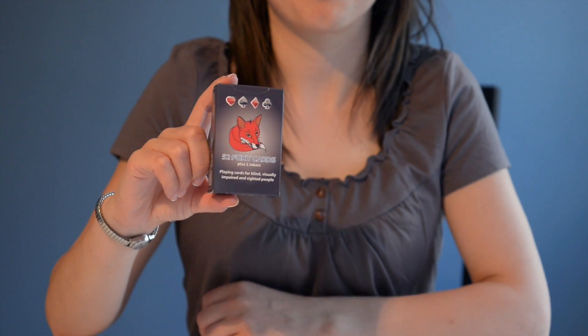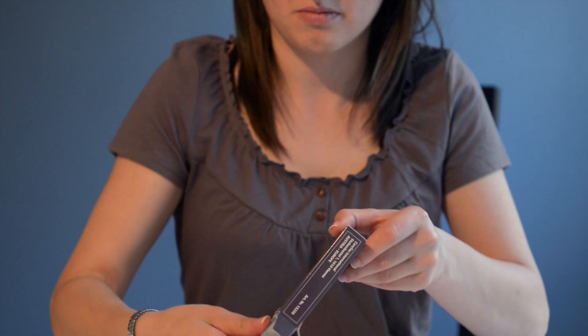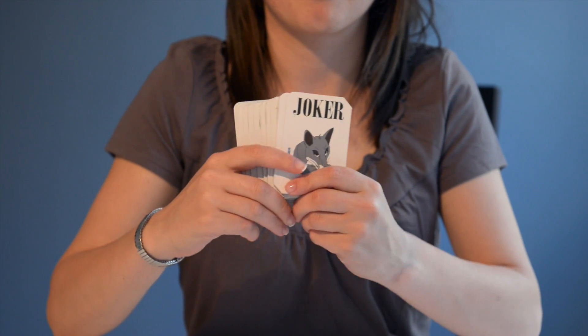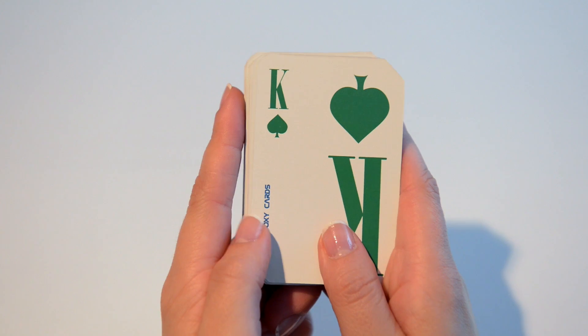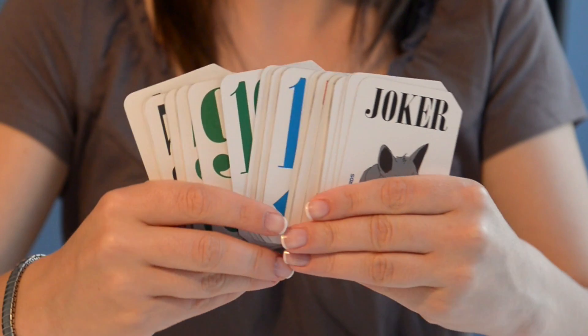Another fun thing you can use the Foxy Reader for is playing cards. We present to you the Foxy Cards. These special cards have small invisible OID codes printed on them that can be scanned with the Foxy Reader. For the first time, blind and visually impaired people can play cards with their seeing friends.